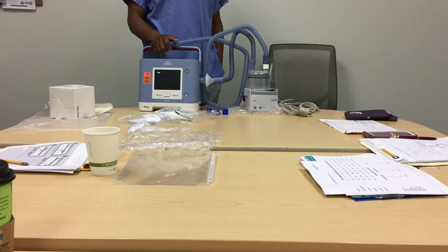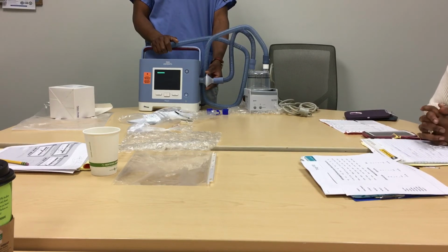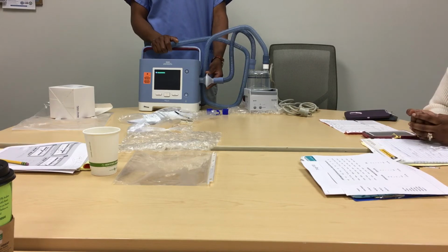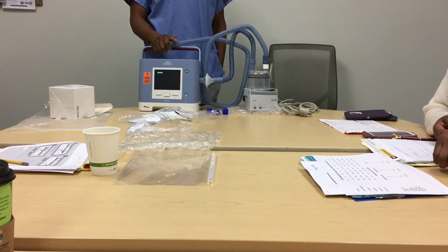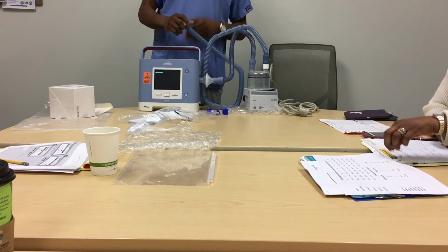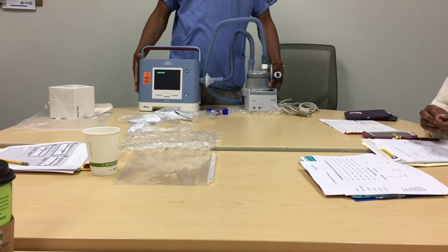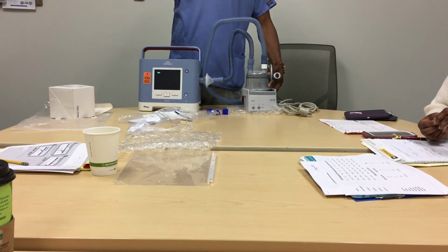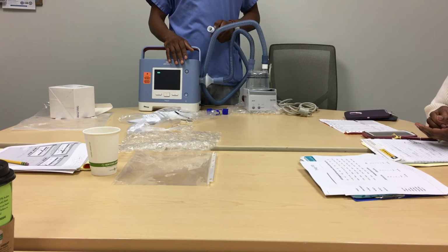A patient asked me and I said, I don't think so. I went and looked, and sure enough. There are cases where patients were coming on the CPAP with a bacterial filter, and I'm like, you don't need it. But we have some really worried patients and they feel better with bacterial filters. They go to YouTube. On the Trilogy, this will come standard on this setup. But if it's on a regular CPAP, I don't recommend it. You just have that one-way valve.